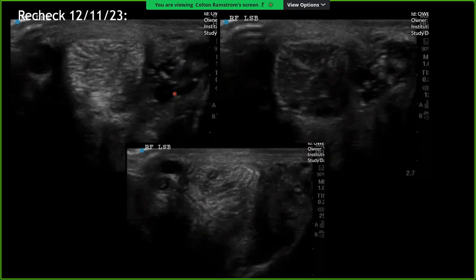I did note that we had some more fetlock effusion on this scan versus the previous scan. Just something to note, something that you could potentially add in as a supportive treatment would be some sort of joint treatment for this fetlock too, just some kind of regional anti-inflammatory, Adequan or whatever you want to do there. And then again here we're looking at those same spots of anechoic or hypoechoic core lesions a little bit further distal. But even those are starting to fill in just a little bit. We see that they're trying to do something.